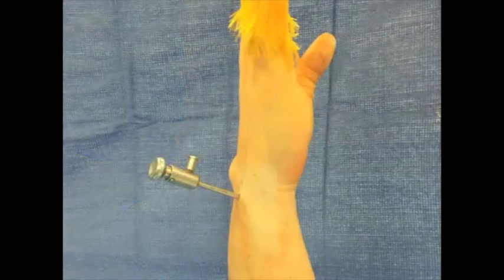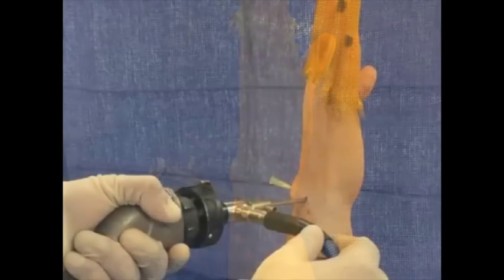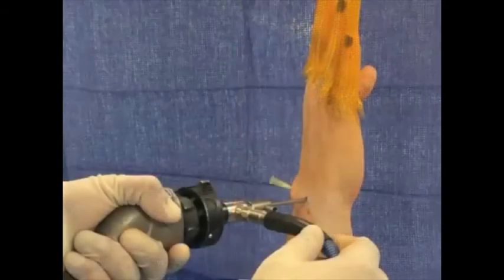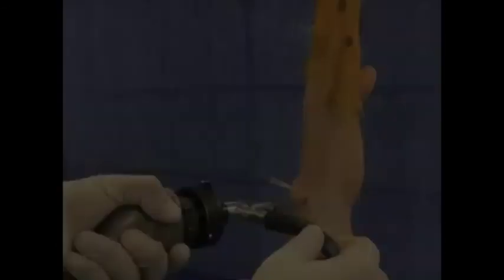A blunt trocar is then placed. The radiocarpal joint through the 6R portal, as well as the midcarpal joint through the MCU portal, are visually inspected, including the capsule, bones, synovia, and joint space, by use of an arthroscope connected to a camera and light source, which is in turn connected to a monitor tower. The camera port is placed at the 6R location.